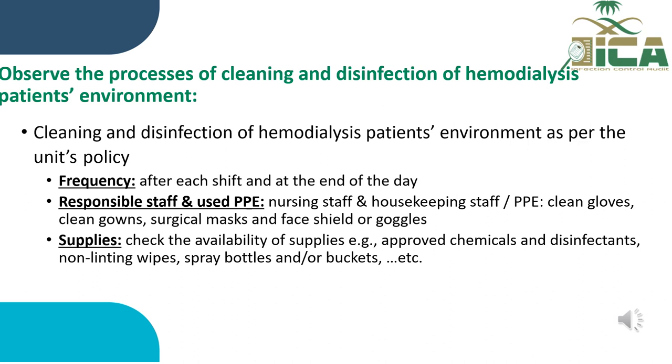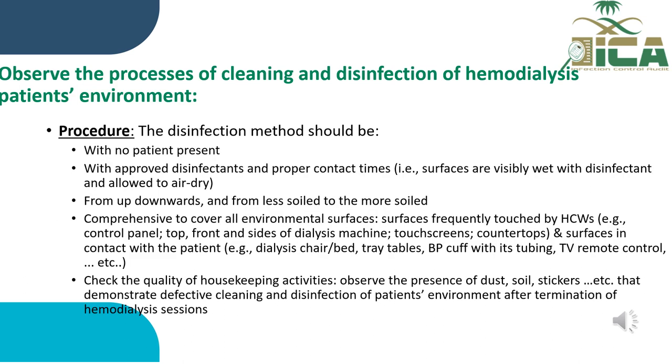Supplies: check the availability of supplies, for example, approved chemical and disinfectant, non-linting wipes, spray bottle, and or buckets, etc. Observe the process of cleaning and disinfection of the hemodialysis patient's environment. The disinfection method should be done with no patient's presence, with approved disinfectant and proper contact time.